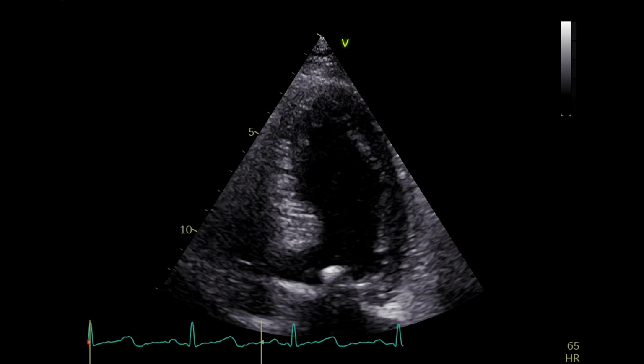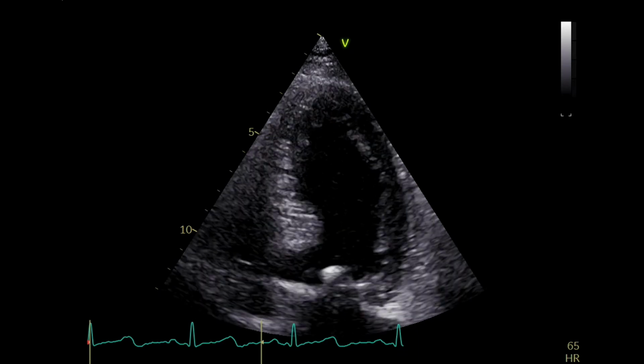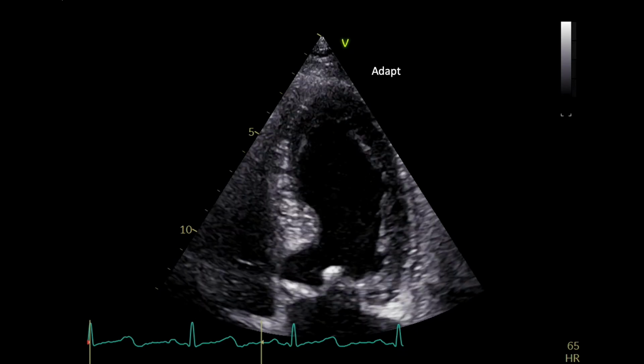The images presented in the following have been processed through the entire E95 chain and are displayed in EchoPac. Here we present an image case from our database before ADAPT is applied. Here is the exact same frame processed with ADAPT. By letting the images alternate in a GIF animation, it is easier to appreciate the quite significant effect of ADAPT. I should mention that this is one of the cases which have the strongest effect of ADAPT from our database.